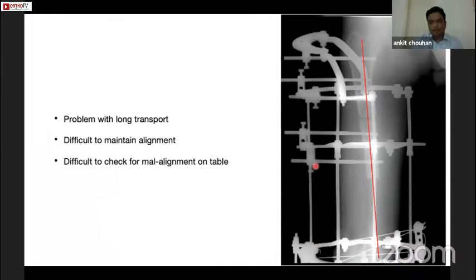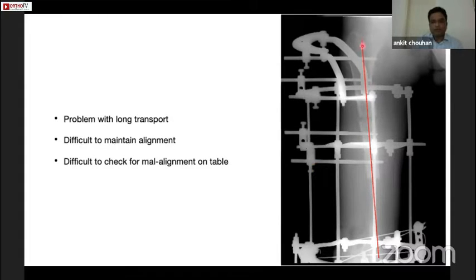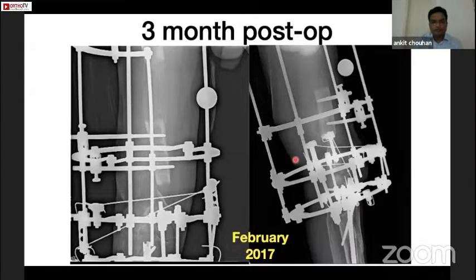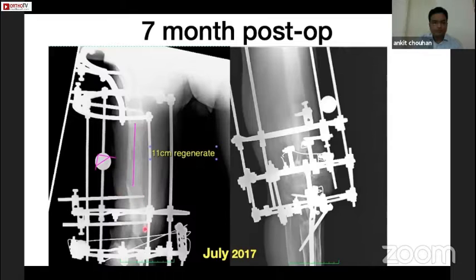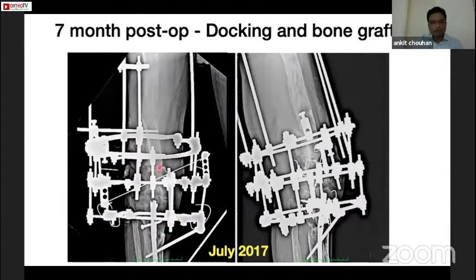Another issue when dealing with large gap non-unions or when a large gap has been created by debridement is getting accurate alignment in both planes, because the field of vision offered on-table by the image intensifier is very limited. As you can see, the mechanical axis of the proximal fragment is not in line with the distal fragment. After six months when transport was complete there was a mismatch, but a good shadow of the regenerate was visible. After seven months the bone consolidated, and a third procedure was done to create alignment and do bone grafting. The frame assembly was changed from a transport frame to a lengthening frame where different sets of rods were correcting different rings, correcting alignment in AP and lateral views.